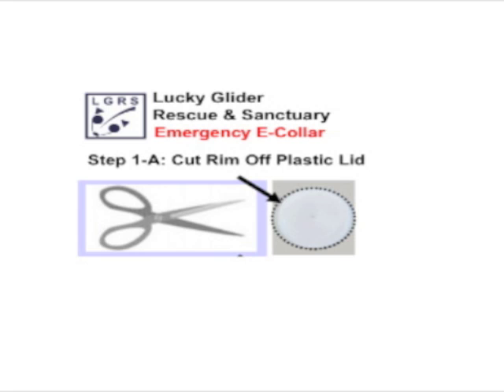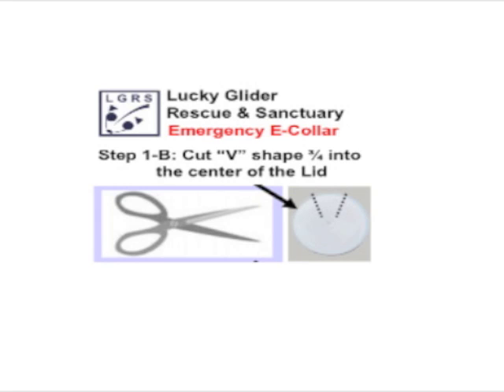The first step of making your emergency e-collar is to take the lid or the plastic report cover and cut the rim off of the plastic lid. If it's a plastic report cover, you can just cut a small circle of the material. Next, take a pair of scissors and cut a V-shape into the lid towards the center of the lid about three-quarters of the way in.